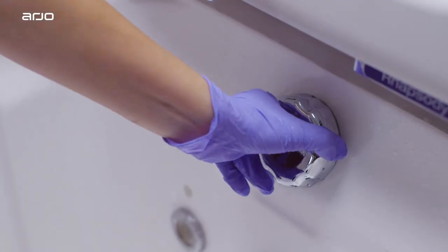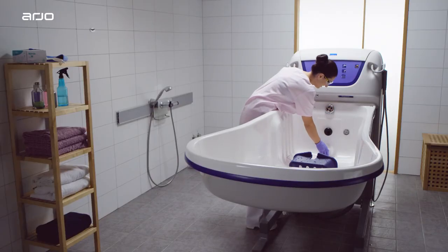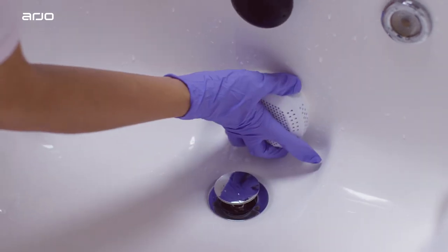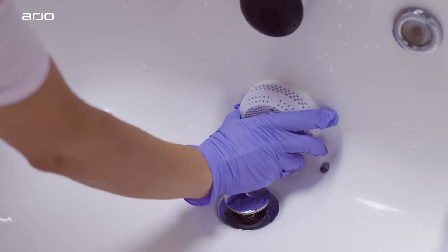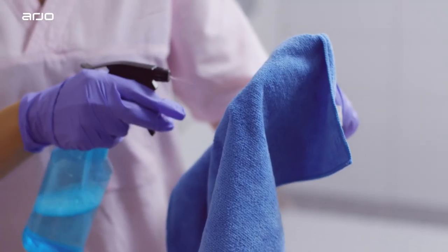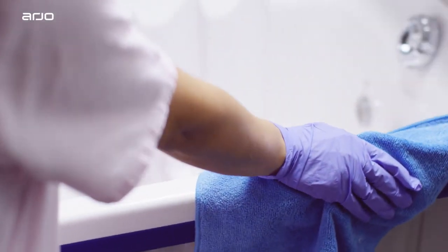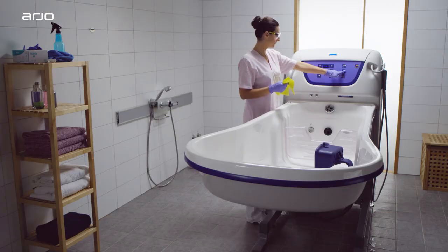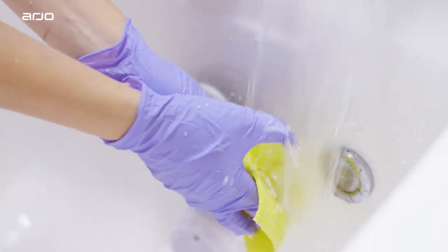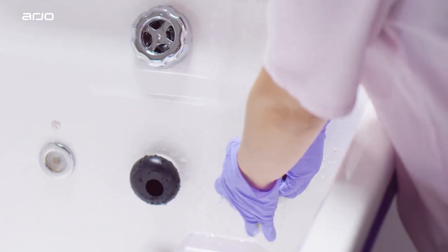Open the drain and remove any excess water. Reattach the suction inlet and close the lock. Apply disinfectant to a cloth and wipe the upper sections of the bath. Rinse the cloth in water and re-wipe the upper sections once more. Rinse the cloth with water once more and perform a second thorough wipe down.